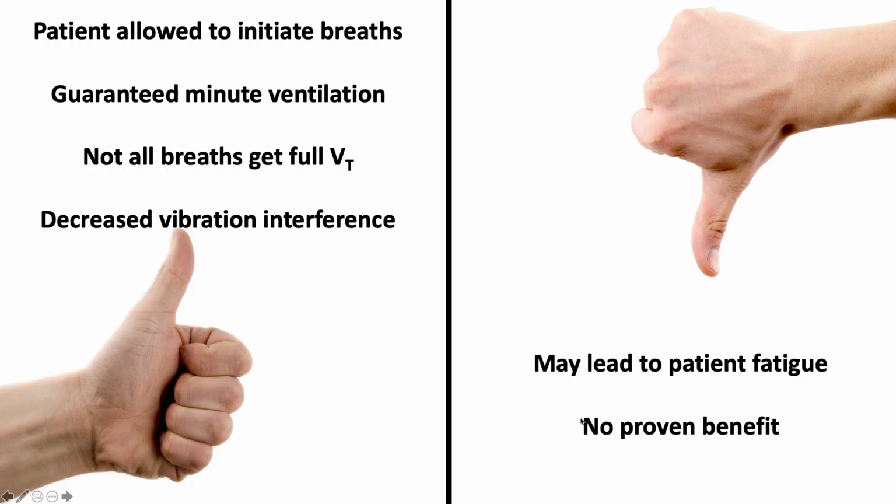Now, the positives of this is the patient's allowed to initiate their own breaths. It can be a more comfortable setting. You also get guaranteed minute ventilation. Minute ventilation is going to be our respiratory rate multiplied by our tidal volume. So you're able to dial that in into SIMV. And if they're taking 40 breaths a minute, they're not going to be getting a full tidal volume every time. So they're not going to be throwing off their minute ventilation. Now, like I said, not all breaths get a full tidal volume, and you have decreased vibration interference.